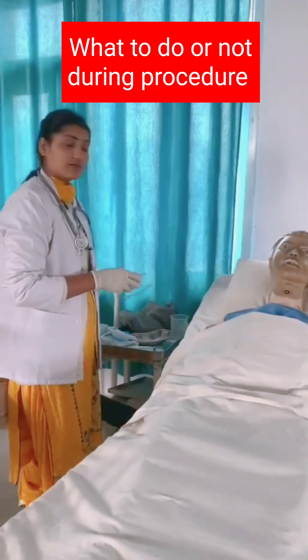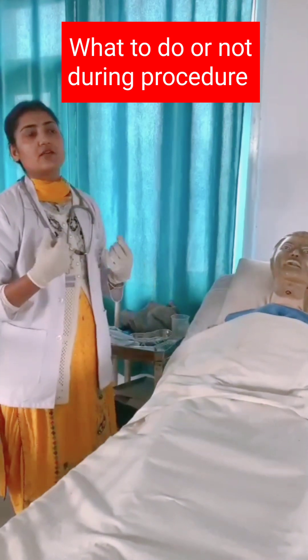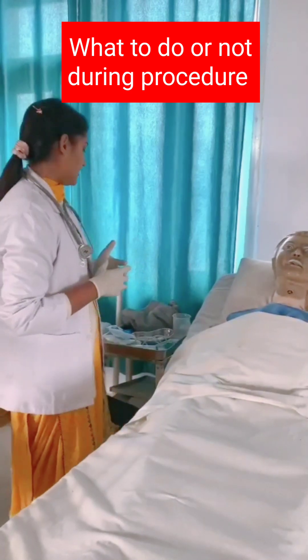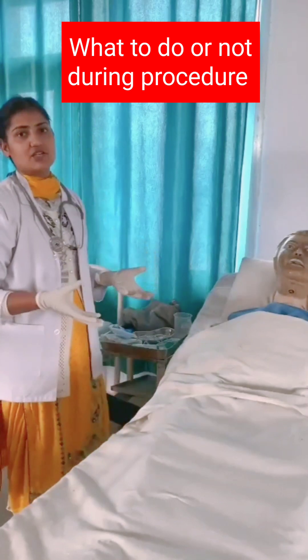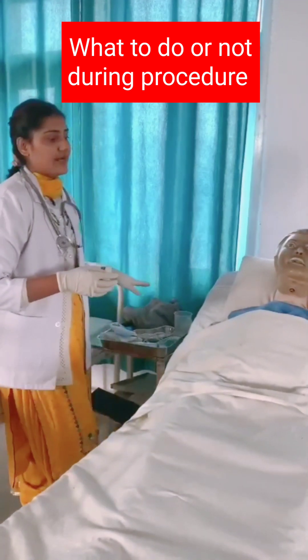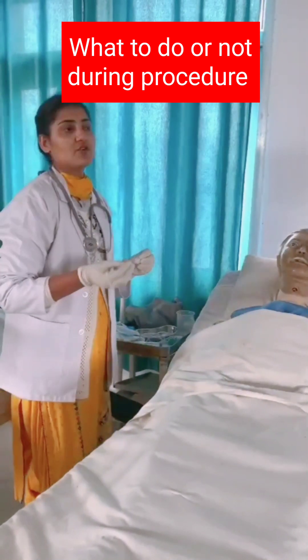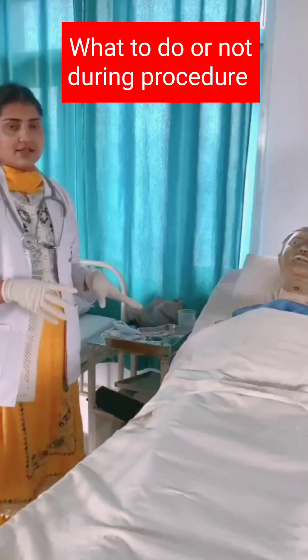Then I need gloves, which will prevent any cross infection from myself to another person and prevent contamination. I need a towel, which I will place under the chin of the patient to prevent any spillage. So these are my articles.